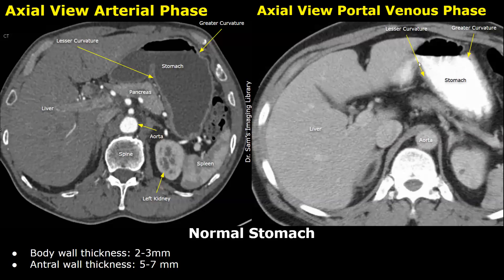This makes it easier to distinguish between different structures. You can see the normal rugal folds more clearly in this image. The wall thickness at the upper and middle parts of the stomach, such as the fundus and body, is between two and three millimeters. It is greater at the lower parts of the stomach, such as the antrum and pylorus.